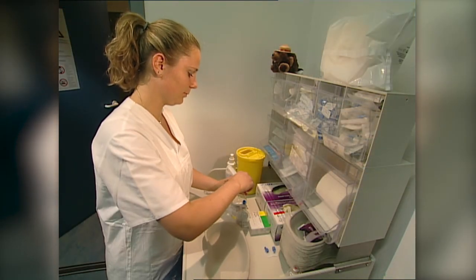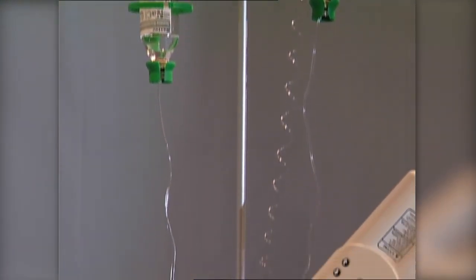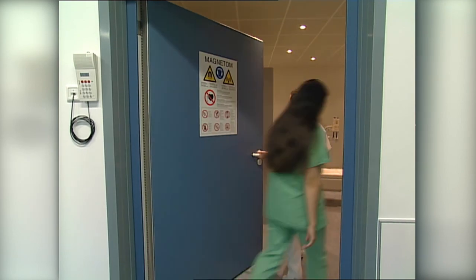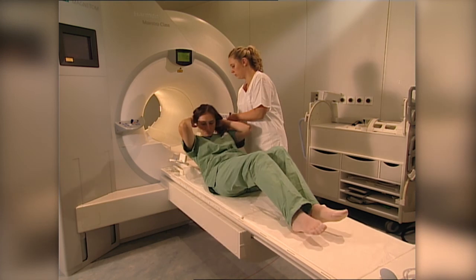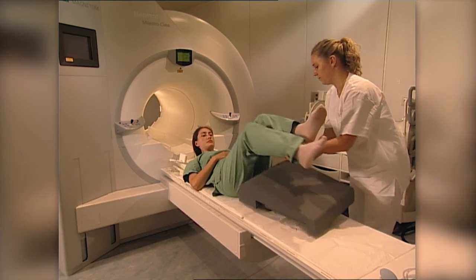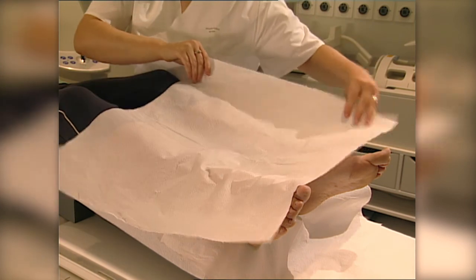Discuss with the patient possible allergic reactions to the contrast medium. This is especially important in the case of pregnant women and lactating mothers. While positioning, be sure not to trap any hair or crush extremities. Always ensure there's sufficient separation between the patient and the magnet bore. Always use the appropriate positioning devices for the safety and comfort of the patient.